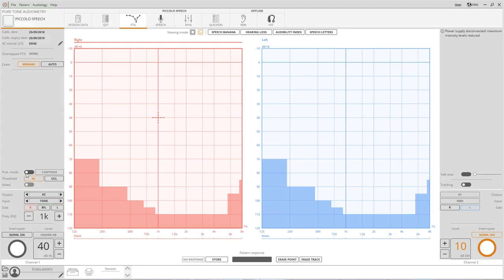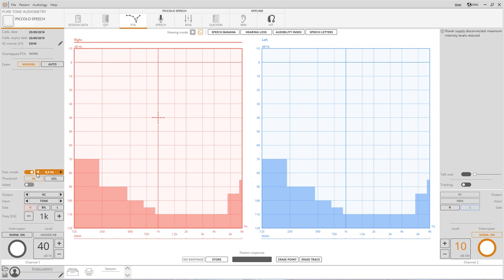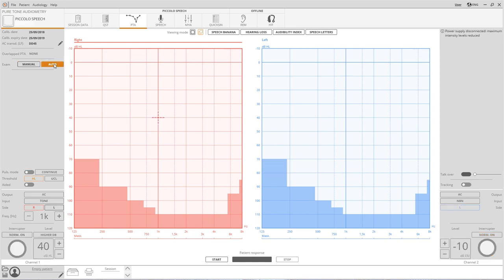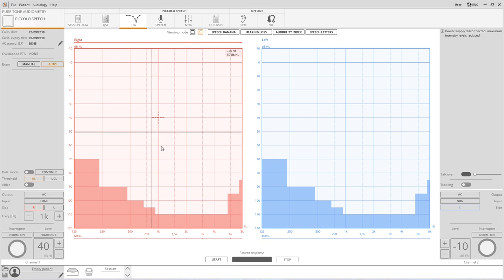Above the channel controls there are settings for a pulse tone option. Tracking is for maintaining the intensity gap. Finally press auto to switch to the automatic test settings.